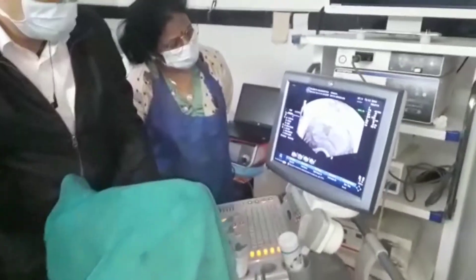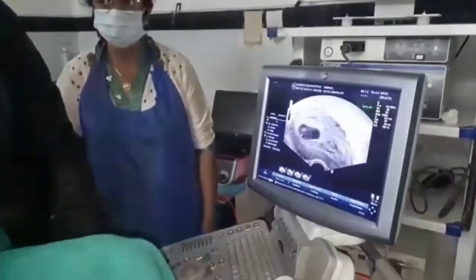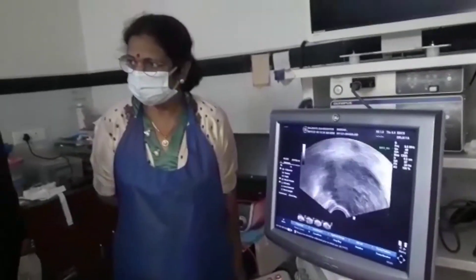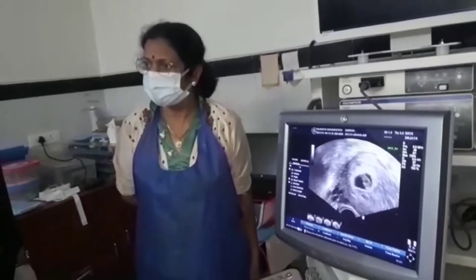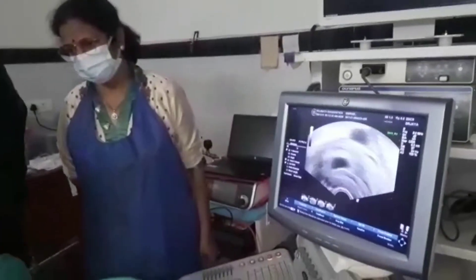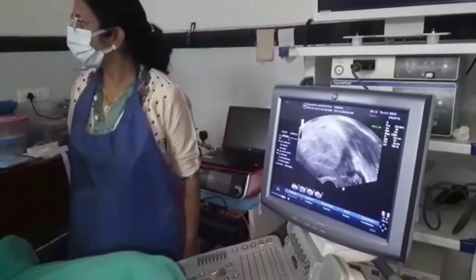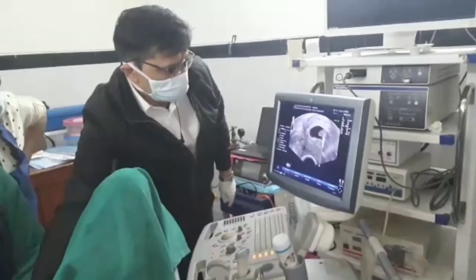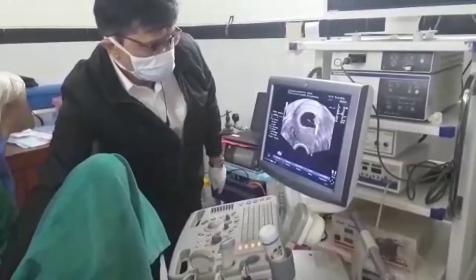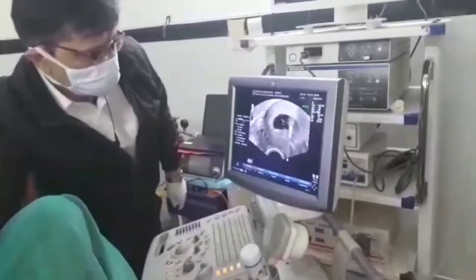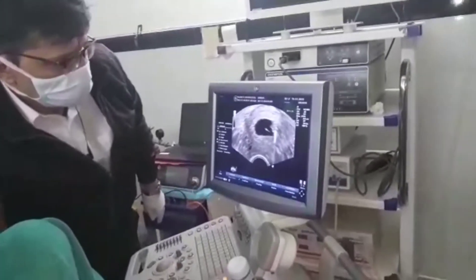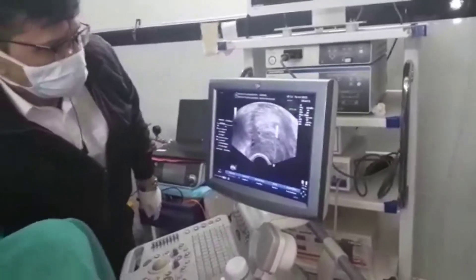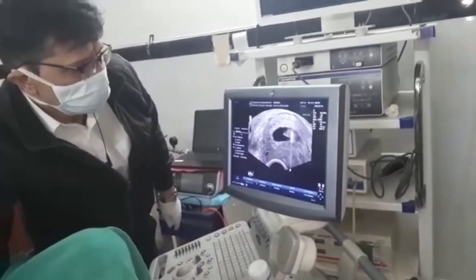We need a team and good ultrasound guidance so that we can spare the great vessels and go pinpoint to the thorax of the fetus to instill the KCL until the heart stops. Once the heart stops, it is easy to dissolve the pregnancy and bring down the serum beta-HCG level.